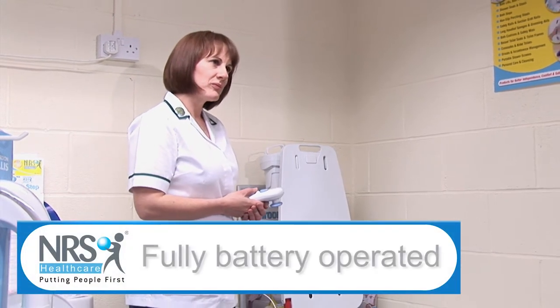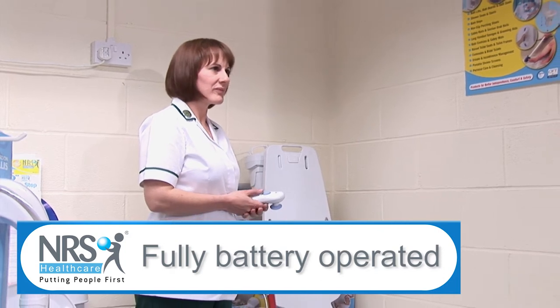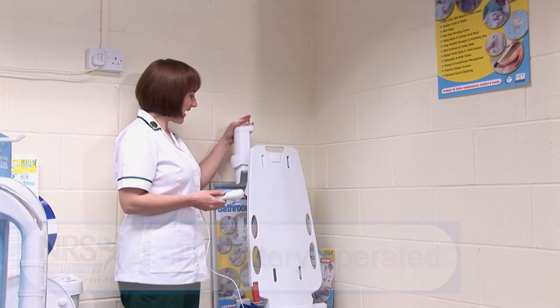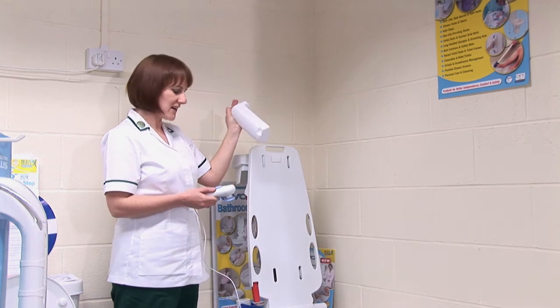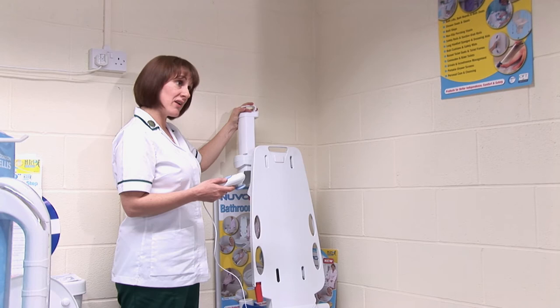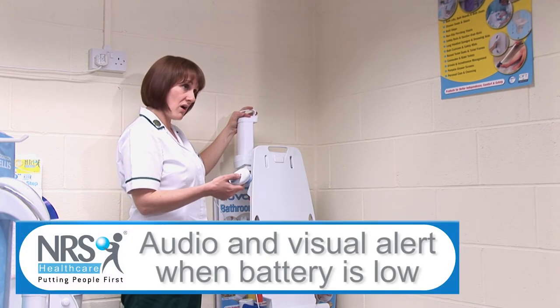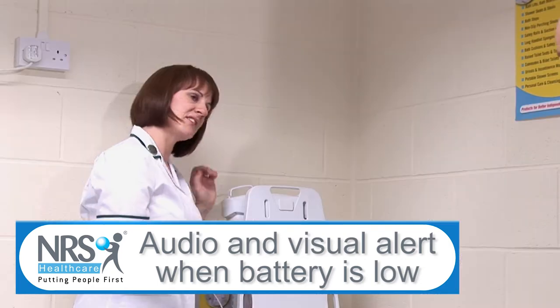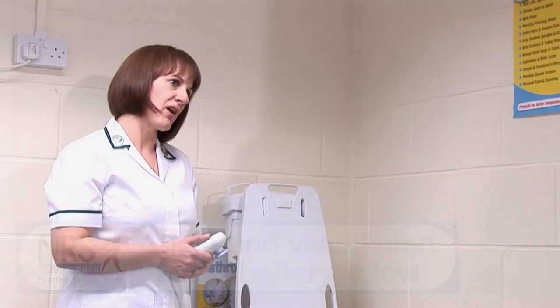Now this is a battery operated piece of equipment, it's not required that you've got to plug it into the mains. The battery is housed in the top here, it's very easy to take in and out. And if it's about to run out, it gives you an audio alert and a visual sign as well. And it won't lower you down into the bath if it's not got enough charge to get back up again.